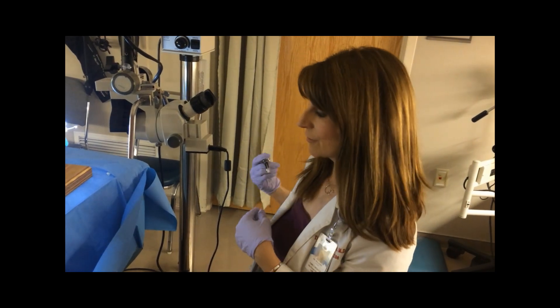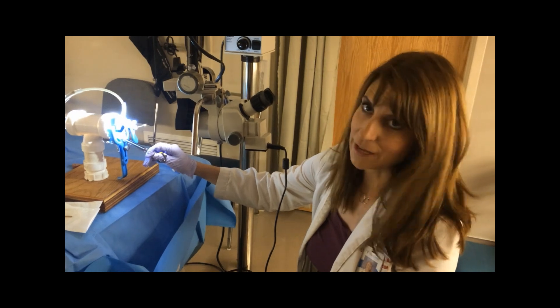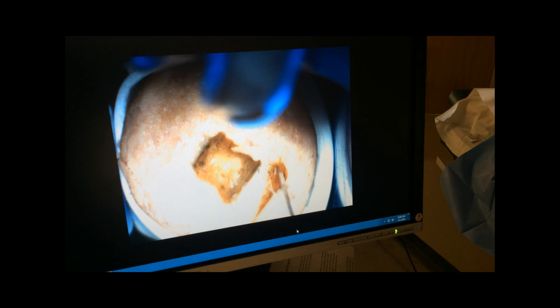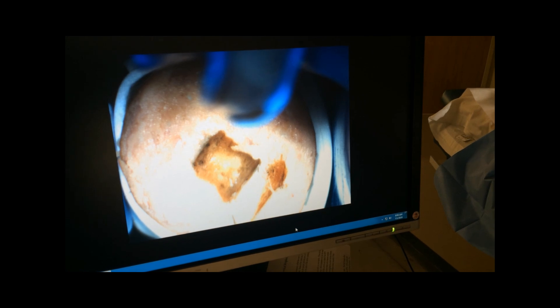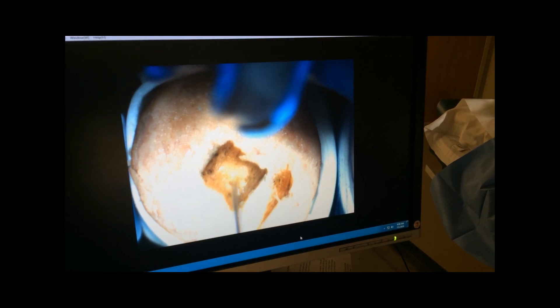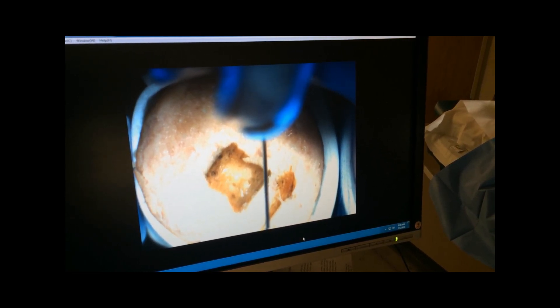When I numb up the cervix, I actually do half a vial of lidocaine with epinephrine at 12 o'clock, then the other half at 3 o'clock. I reload the vial and do another half vial at 6 o'clock and at 9 o'clock. I then reload with another vial and do either a half or a quarter of a vial between all of those locations.